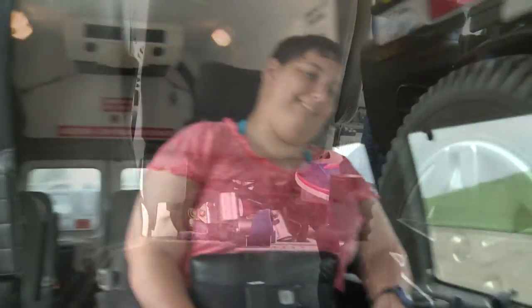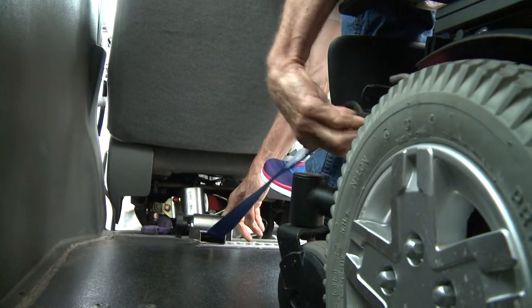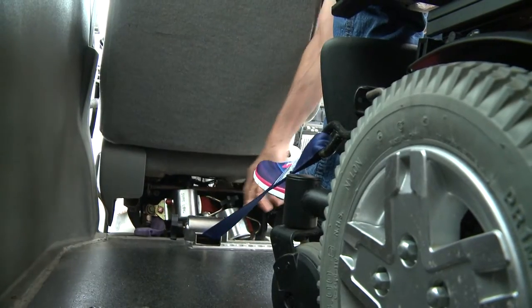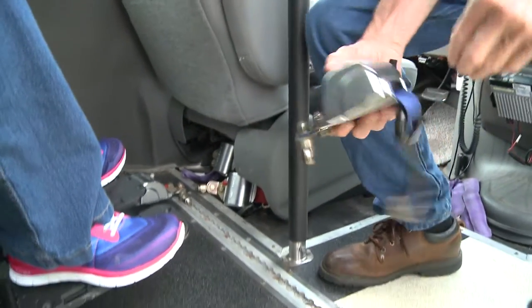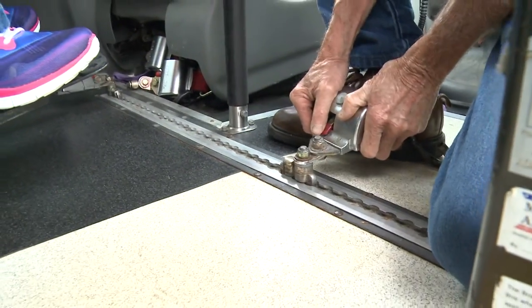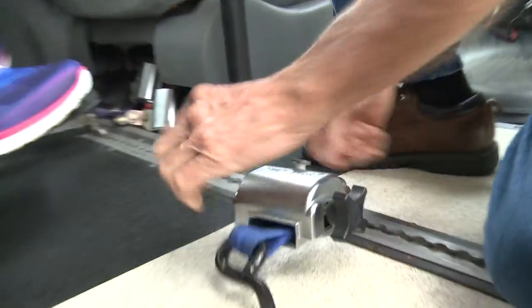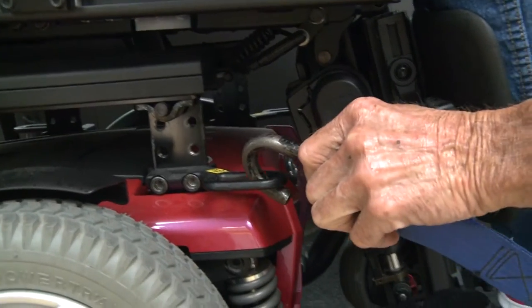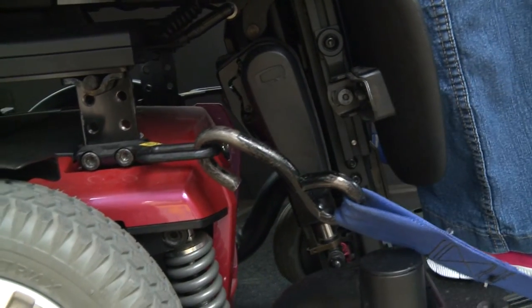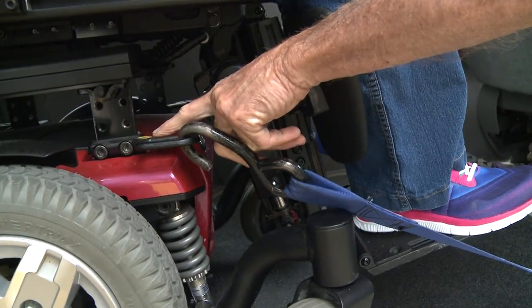We'll start with the fronts first. Push the red button, pull the retractor out, hook it to the securement point. Now we're going to do the other side — put your retractor into the floor tracks like this, make sure they're snug and will not come out of the floor. This particular mobility aid has built-in rings which we can utilize — they look like a good securement point, and even have a little hook marked on there indicating where they're to be used.